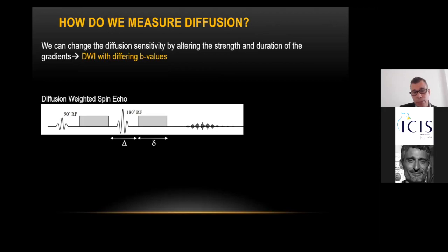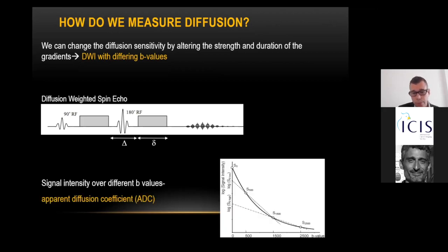And this enables two things. First of all, by plotting out these various calculations of the signal intensity on diffusion-weighted imaging, we can estimate the apparent diffusion coefficients. This gives us a quantification of our values. It also removes the effect of the T2 weighting to the diffusion-weighted imaging.